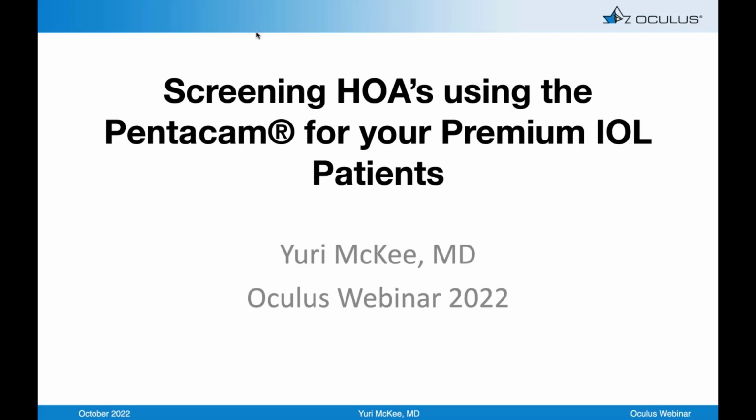And I think you see I'm a little bit biased against multifocal or EDOF because in almost every one of these cases, there was something higher order aberration-wise or refractive result-wise that would have precluded a likely successful outcome. Now, in normal eyes, when you look at all this and all the stars align, I feel really good about these advanced IOLs. But in unusual eyes, this is the data I need to show patients and other surgeons that maybe that's not the smartest thing to do. You're rolling the dice on whether they're going to have a good outcome or not.